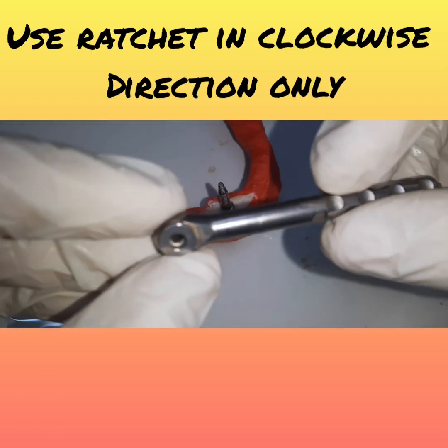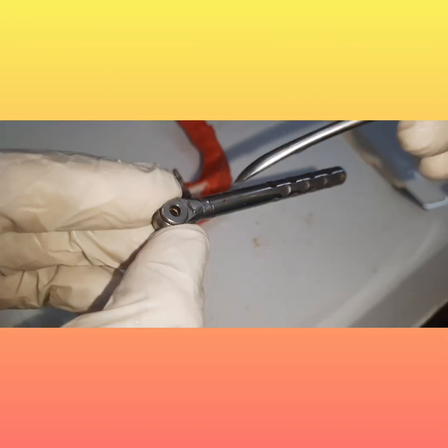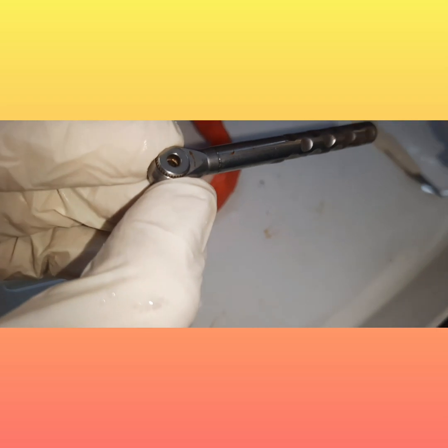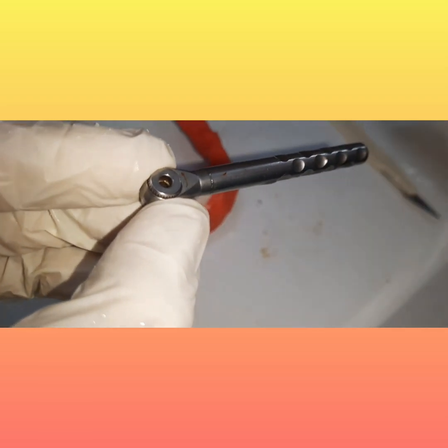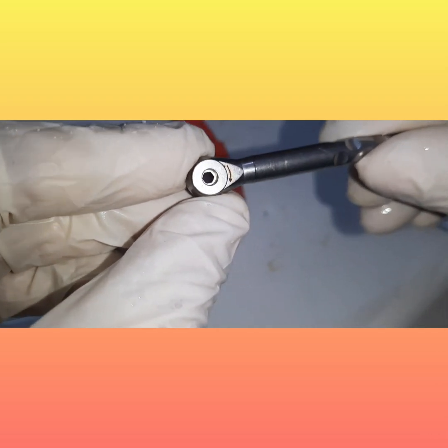Then you're going to use the ratchet. So first thing which you have to see in the ratchet is, if you can carefully see, you have to use the clockwise direction for placement of the implant. If you're using this anti-clockwise direction, then that is for removal of the implant. So I'll be using the reverse of this. I'll be using this for placement of the implant. Can you see the arrow?